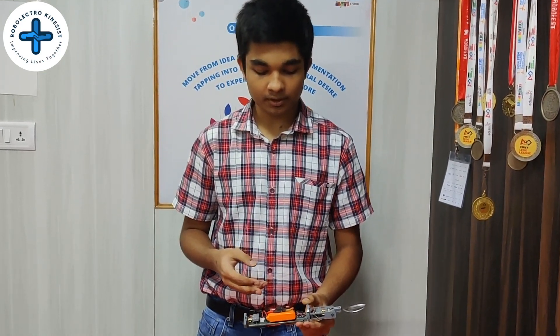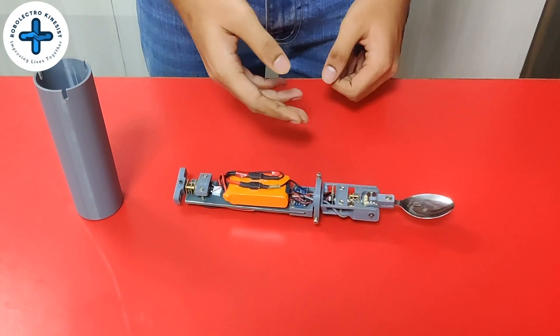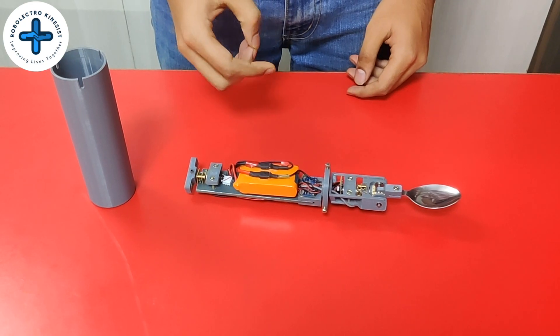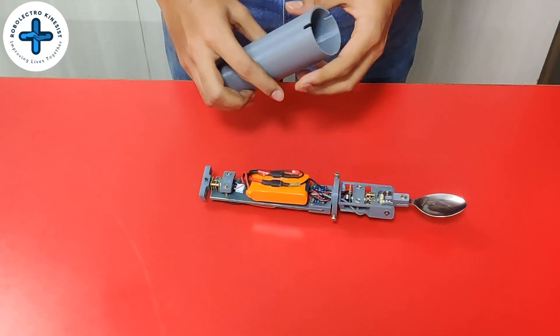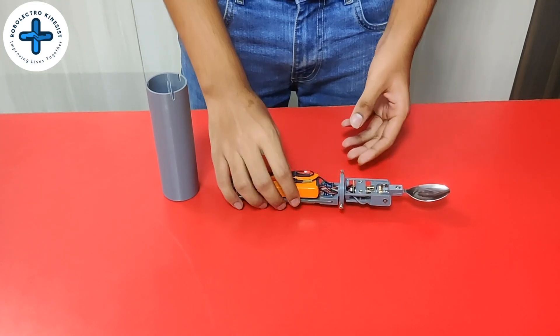Let's make a smart spoon. Over the last one and a half months, we researched on the problem, talked to multiple experts in this field, and built many prototypes. This is our final prototype, the smart spoon. It measures the tremors faced by Parkinson's patients using the IMU and intelligently corrects for it using two motors, a microcontroller, and a battery. We designed all the prototypes in CAD and printed them using a 3D printer so that they can be customized.